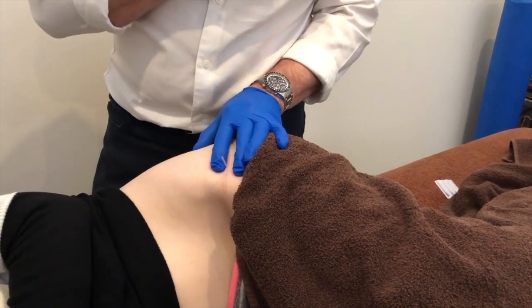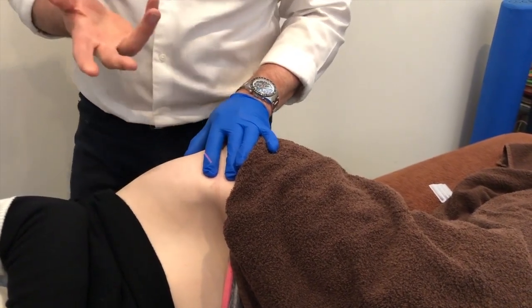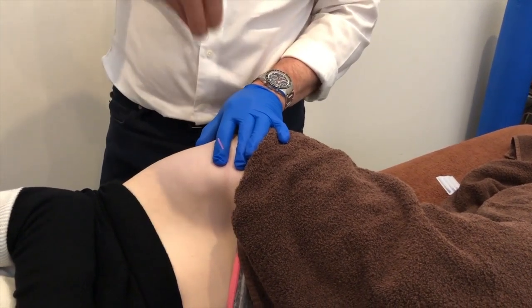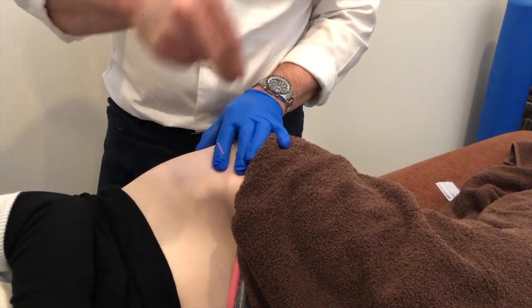That's really straightforward, okay? So that can give you great results in your level 6, level 1 to 5, or whatever the result you want to look for. So the straight down maneuver, straight down like this, when you've got 2 fingers here, the thumb there, going straight down, that's going to be great.